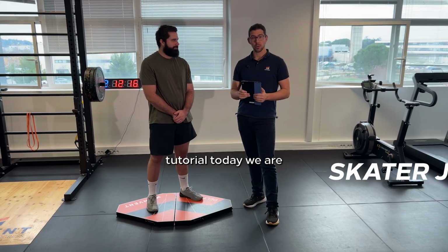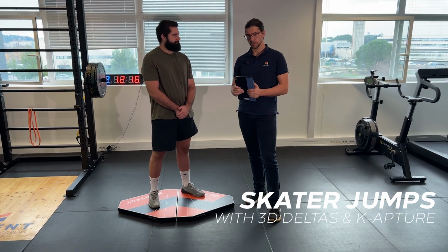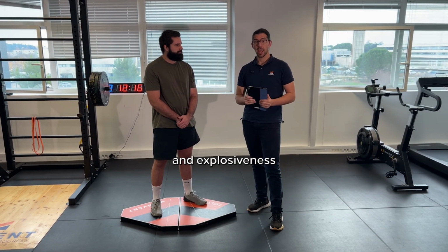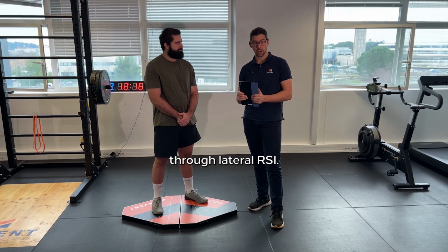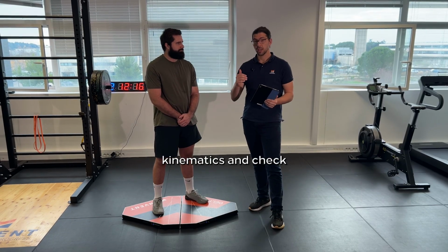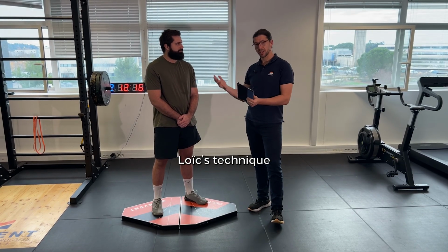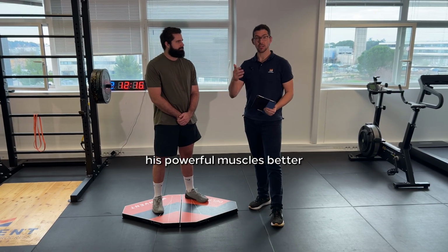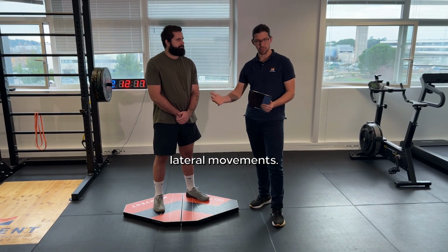In this tutorial today we are going to analyze skater jumps, and with the skater jumps we are going to check exit speeds and explosiveness through lateral RSI. Parallel to that we are going to check kinematics and check how we can enhance Loic's technique so that he's more explosive and can use his powerful muscles better when he does lateral movements.